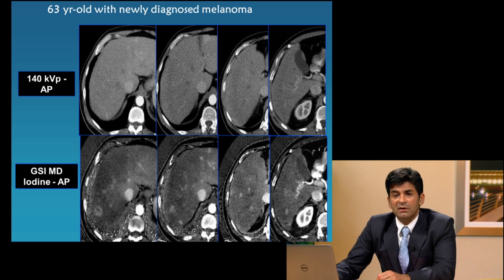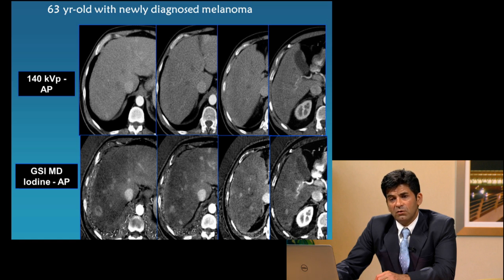Now in tumor imaging, there are tremendous benefits in improving diagnosis. I'm showing you this first case of a 63-year-old woman with a newly diagnosed melanoma, and as we know, melanoma is a deadly cancer, and accurate staging is desired for treatment selection.